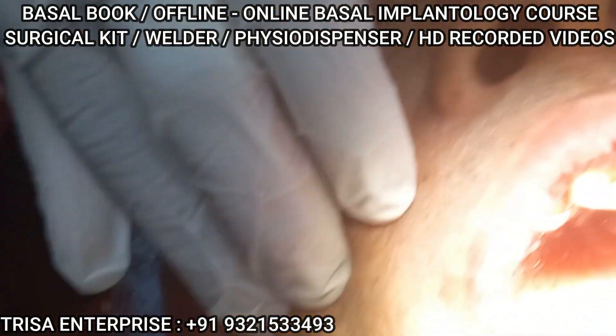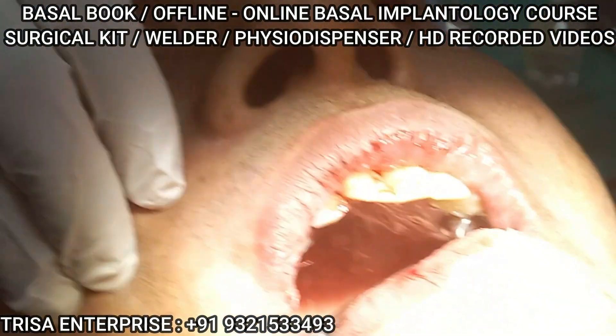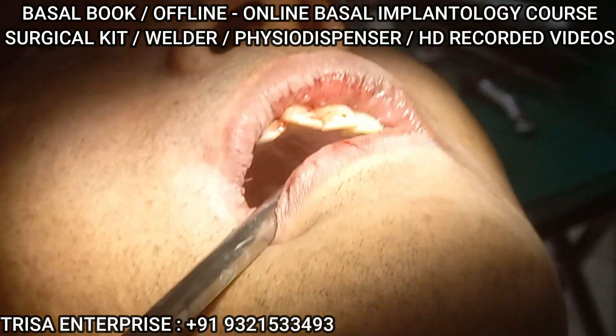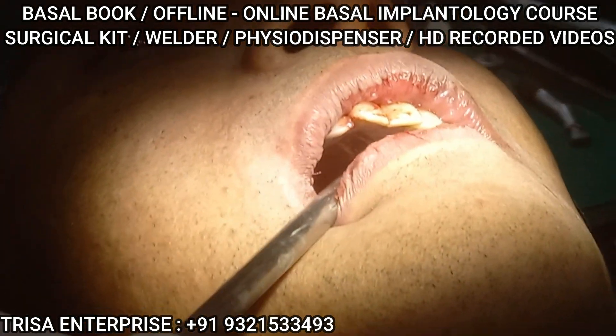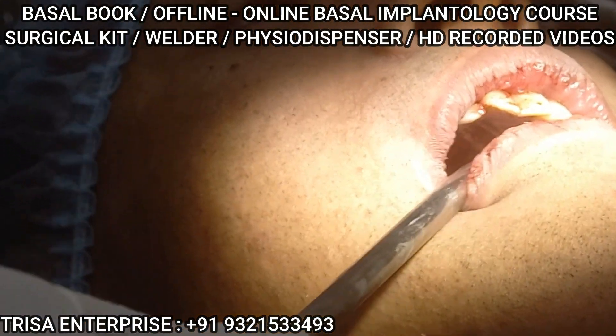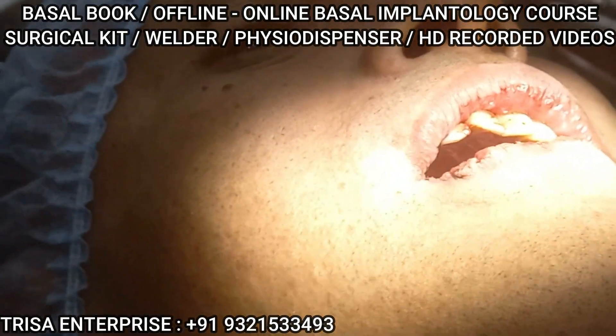You find a soft dip and then a hard dip. 2.5, 26. We have full depth — full depth. 26. 2.5, 26. It's the length of the drill. The length of the drill is 30 mm. Very well. 26 mm.